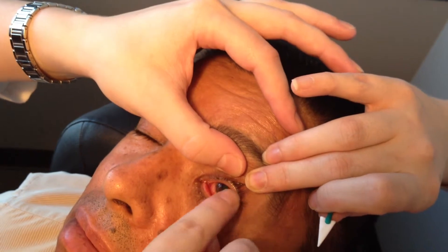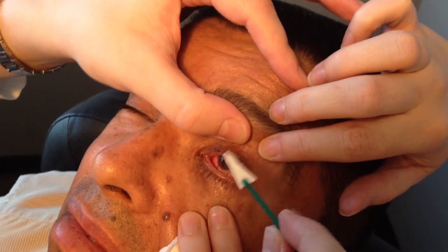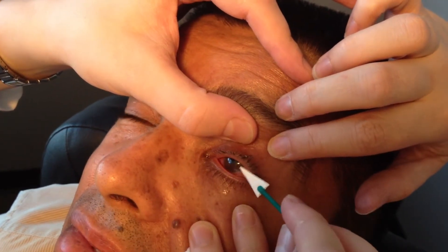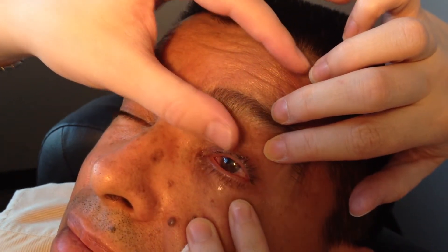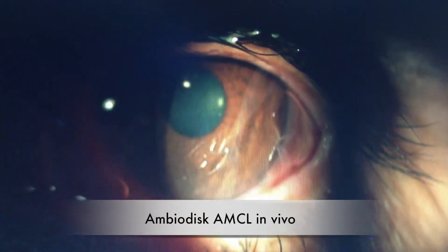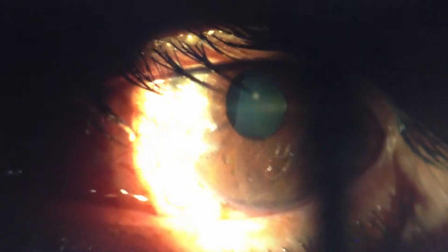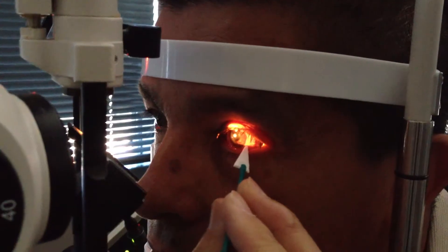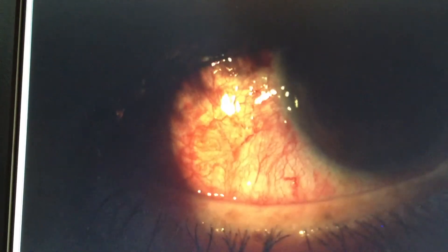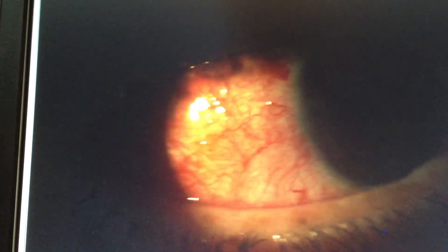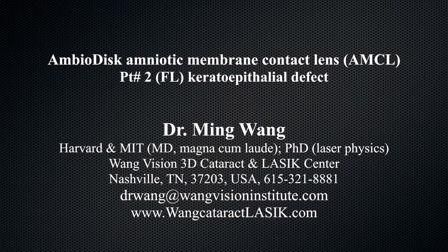Now we put a numbing drop in the patient's eye, then place the Ambiodisc Amnion Membrane Contact Lens on the patient's eye — a case of post-pterygian excision with sectoral limbal stem cell deficiency and corneal epithelial defect. Here you see the Ambiodisc Amnion Membrane Contact Lens in the eye. You can see a fold of the amnion membrane underneath the contact lens, and this is the side where the pterygian has been removed and the membrane has just been applied, covered with the contact lens.